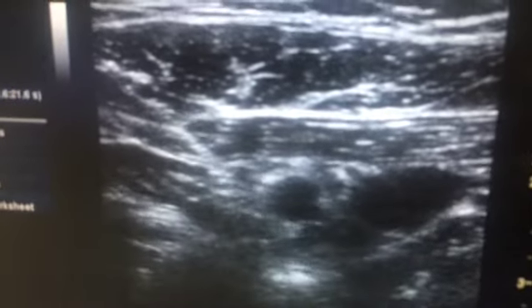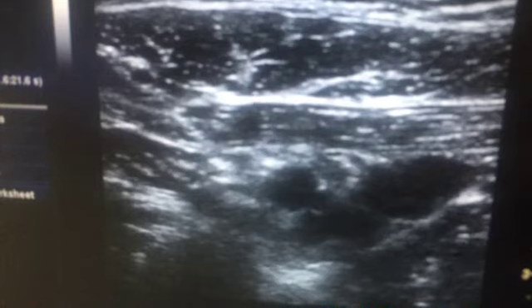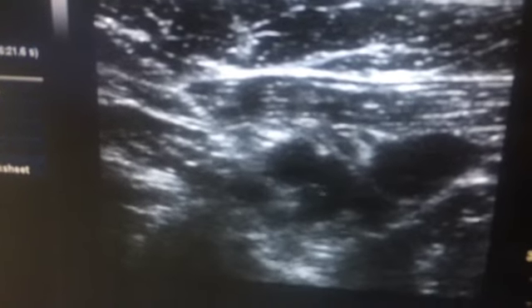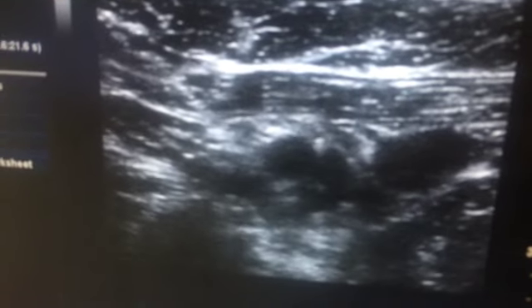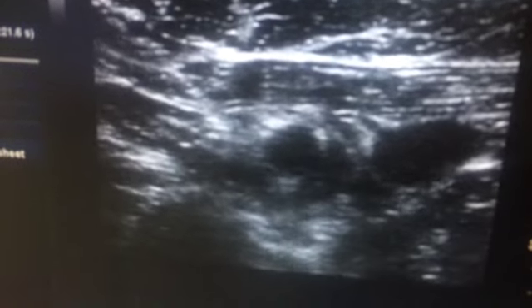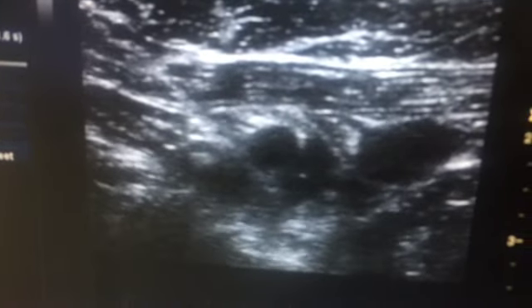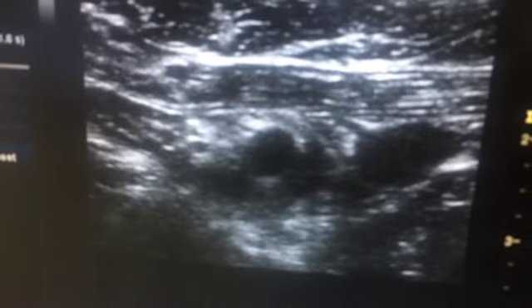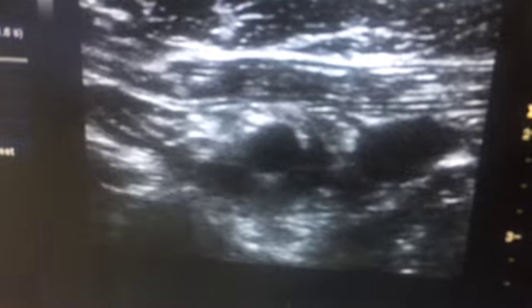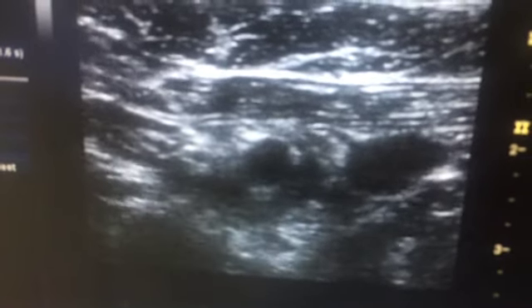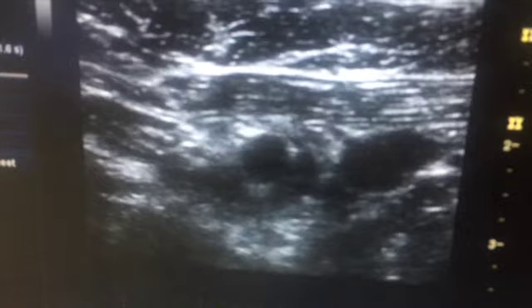I started injecting the drug and you can see the nice spread of the drug posterior to the artery, blocking the posterior cord. Even if I give 30 ml of local anesthetic here it would block, but since I am doing ultrasound-guided, I will block all cords separately.